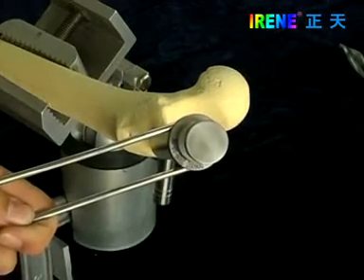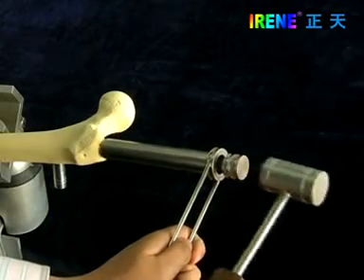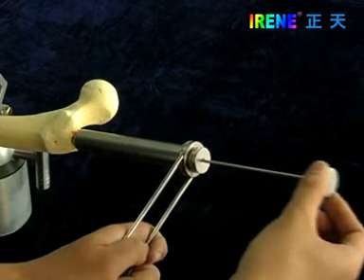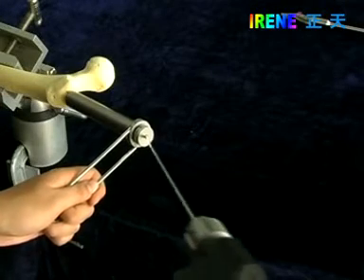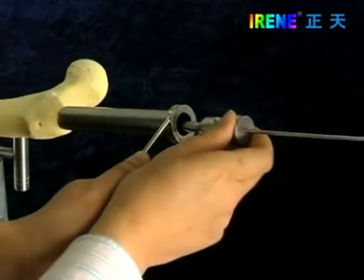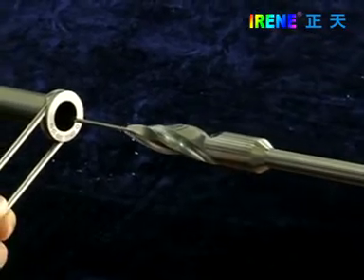Insert the drill sleeve and pin through the protection sleeve and insert the threaded guide pin using the power system. Take out the drill sleeve and use the proximal reamer for expanding the canal.